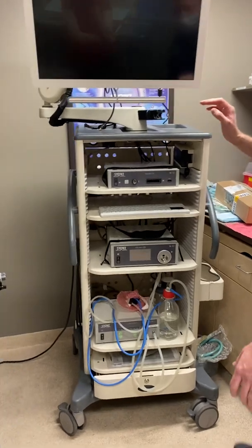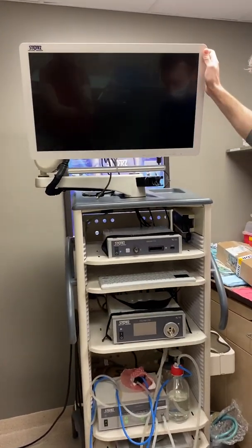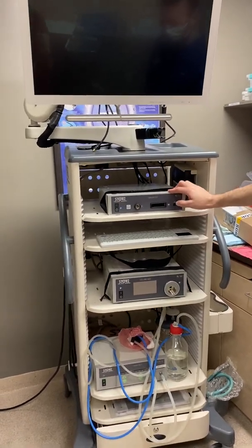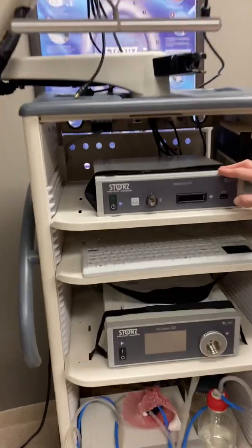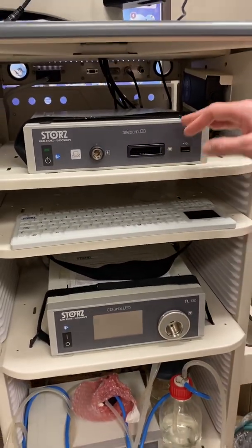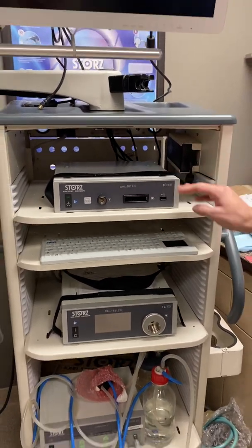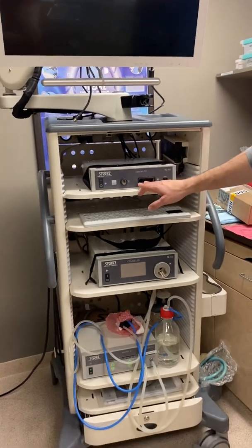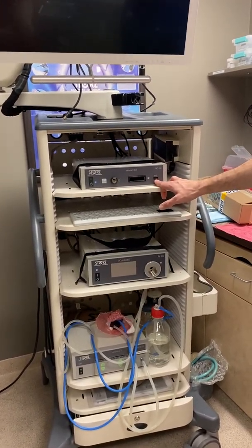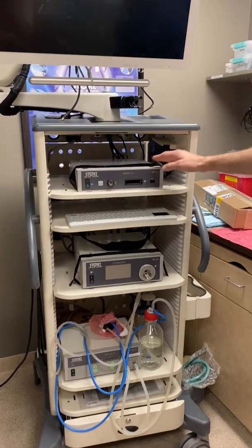To start, you have your full HD monitor up top here — you can swing it around. The first box you see here is what we call the Telecam C3, which is basically the video unit. This is where you're going to plug in your camera head for the system. There's a port for the camera head and a USB port for saving pictures and videos.